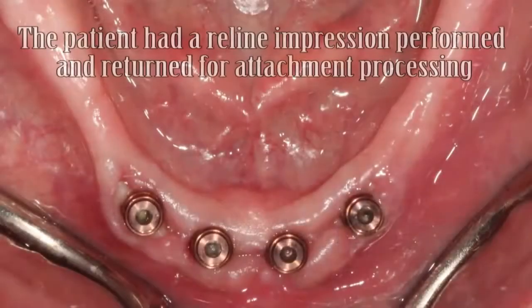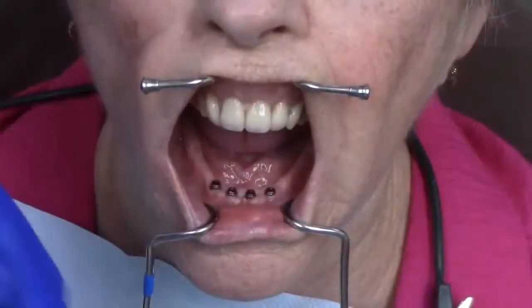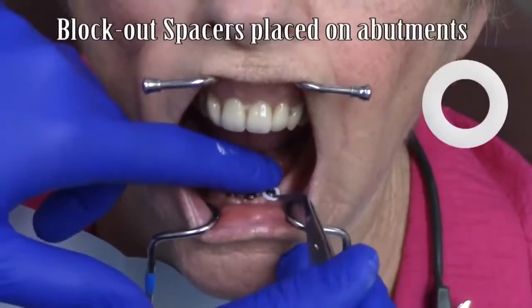Locator and Locator RTX attachments for overdentures. This video is a clinical technique demonstration illustrating denture attachment procedures employed with Locator RTX.